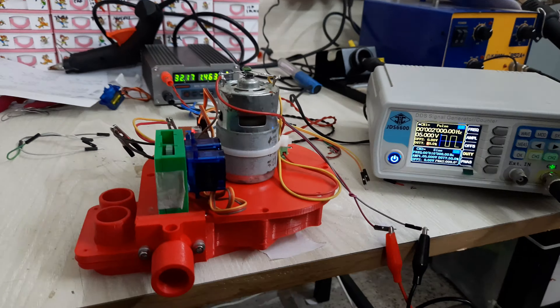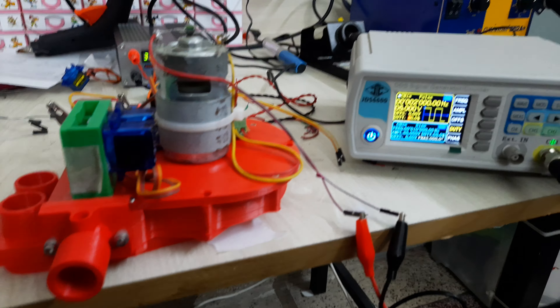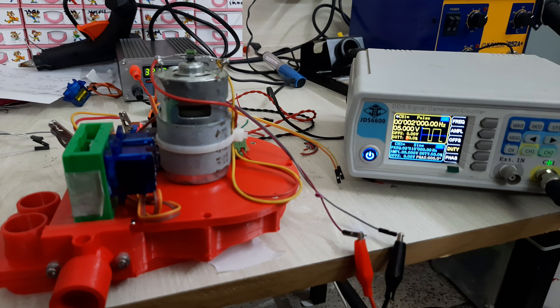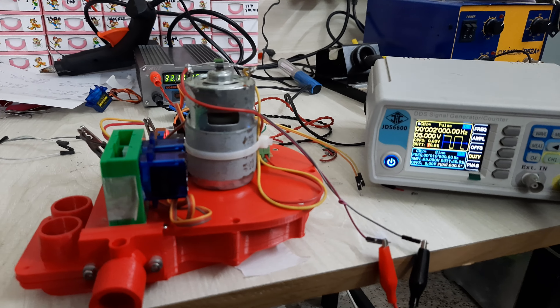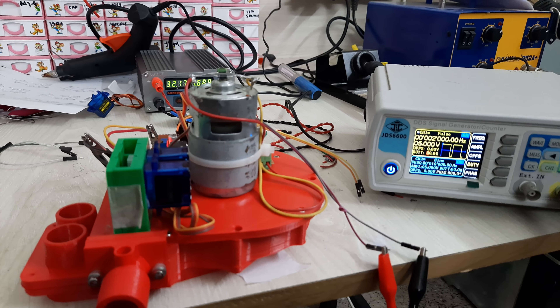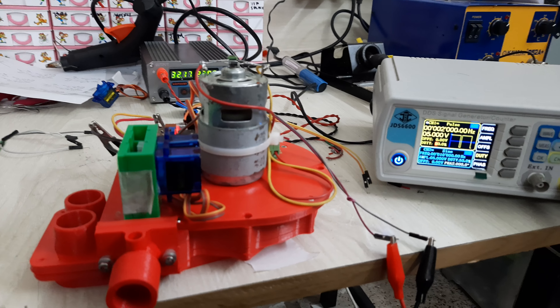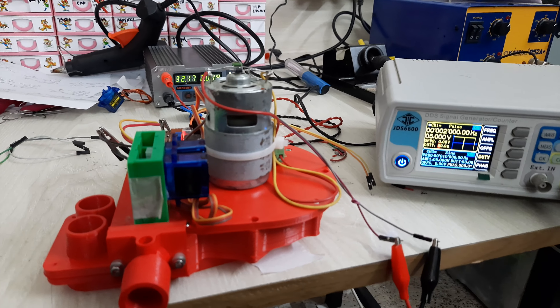Now I am increasing the duty cycle further — 70%, 80%, 90% — continuing to increase the duty cycle.